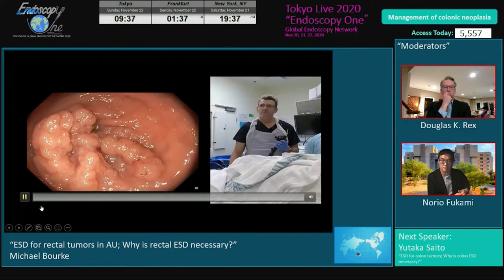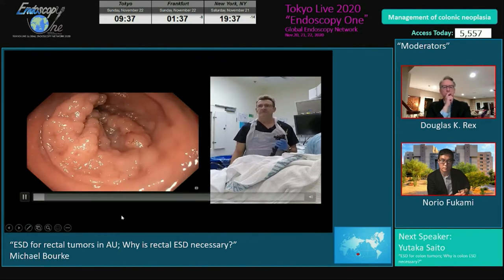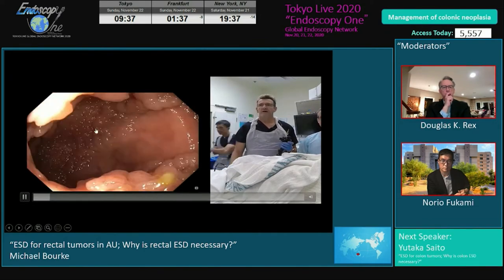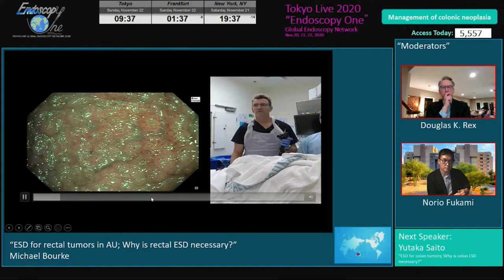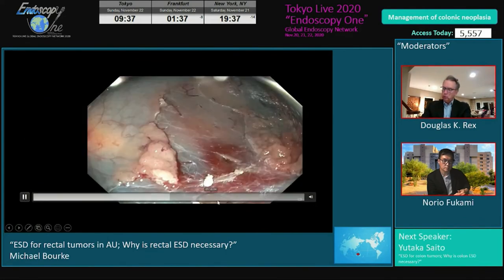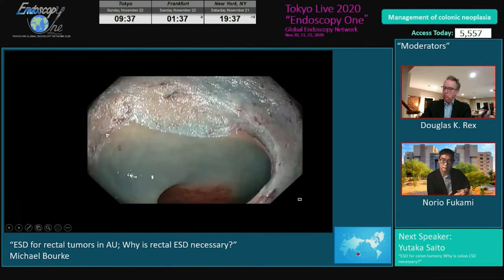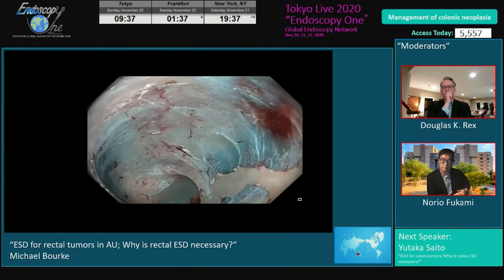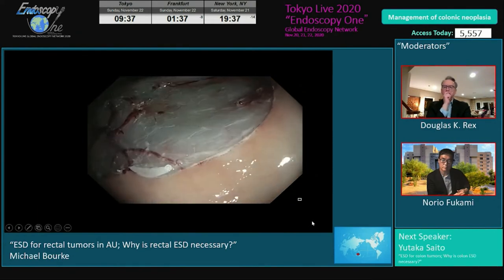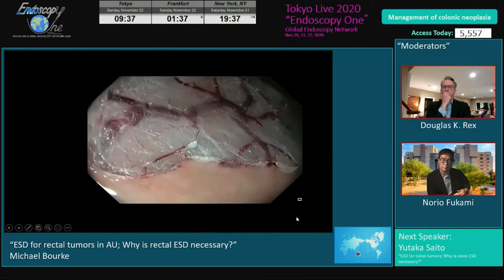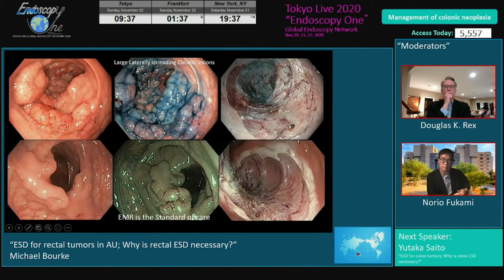Here's an example of what can be achieved by EMR: a large lateral spreading flat lesion in the proximal rectum in a physician referred to our service who was actually sent for surgery. After careful inspection, we can fully remove it. You see a beautiful post-EMR defect — this patient will not get a recurrence, particularly if we do snare tip treatment of the margin. This takes about an hour and a half; by ESD, that's an all-day job with the patient no better off.